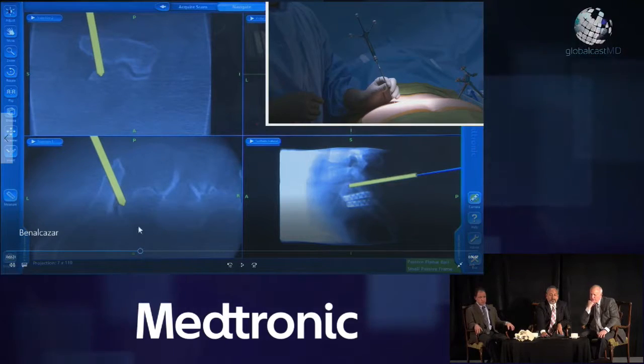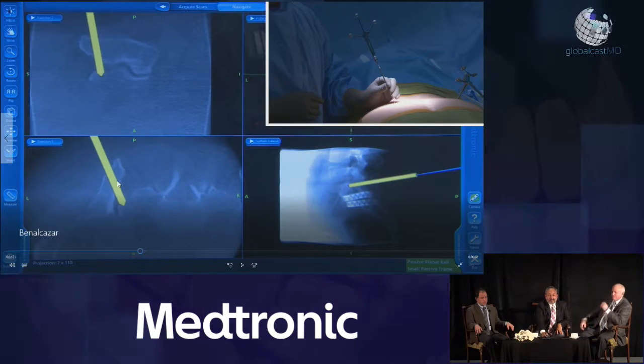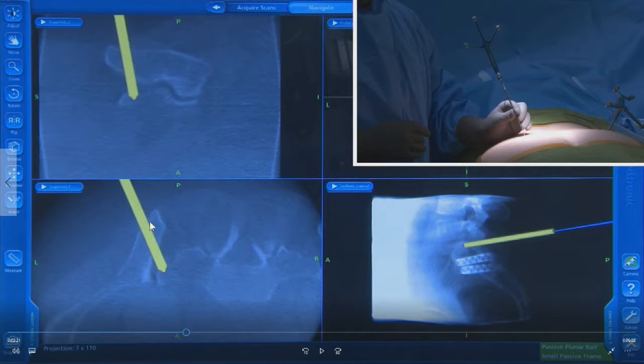Could you comment on the lower left picture — specifically the area in which you went into the ilium? It's not really on the very top, is it? No, it's not. What we're looking at here is an oblique coronal view of the sacroiliac joint — this is superior, this is inferior — and it correlates with the plane we're cutting here. So we're not on the tip; we're right off the tip. This is one slice, so it appears to be a tip but it's not — it's a ridge that runs all the way along. This is very strong. Someone mentioned they weren't afraid this tip might fracture off — it's never happened, and looking at the anatomy, it's just not something I think would be likely.